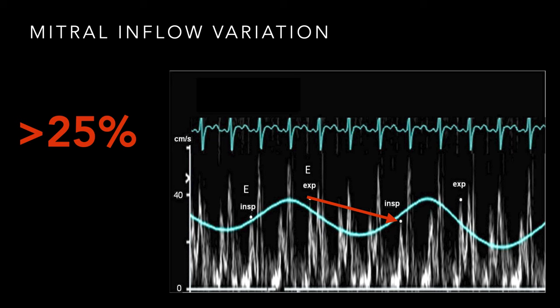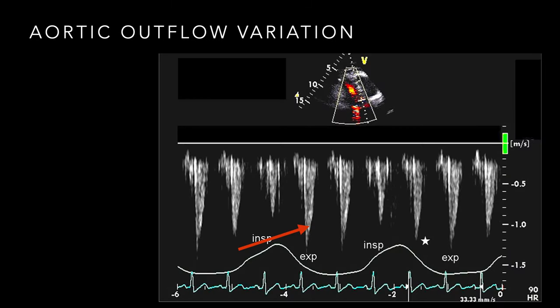The same phenomenon applies to mitral inflow variation. Place the pulse wave gate at the mitral leaflet tips using the same technique. Greater than 25% variation is considered abnormal for mitral inflow. Additionally, aortic outflow tract variation uses a pulse wave gate on the LVOT and shows decreased velocity beat to beat with respiratory variation — a third valve site to assess.